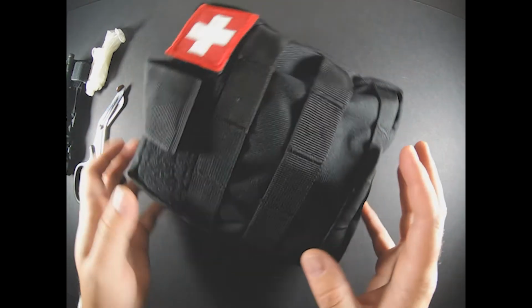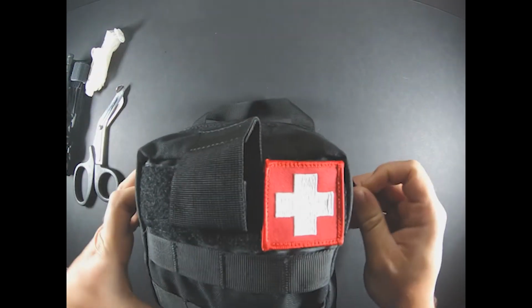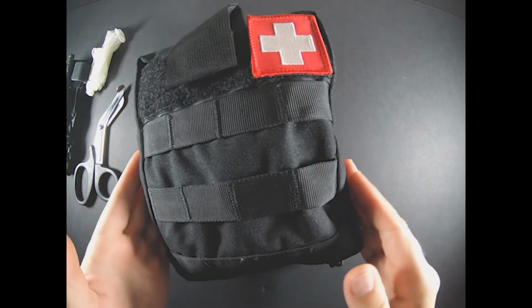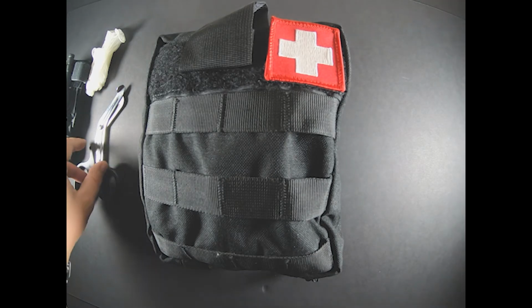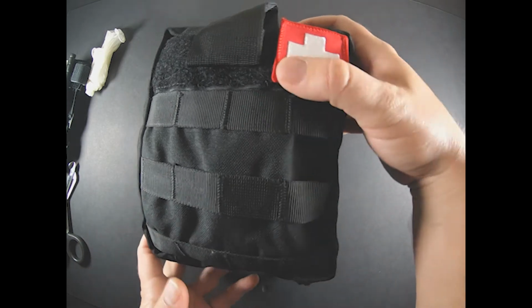All right, moving on to the inside. I always recommend to keep both of these little zippers at the top. That way it makes it very easy to open. This bag itself is actually separated into 3 sections. So I'll open it and kind of go section by section. So you'll see when I open it.